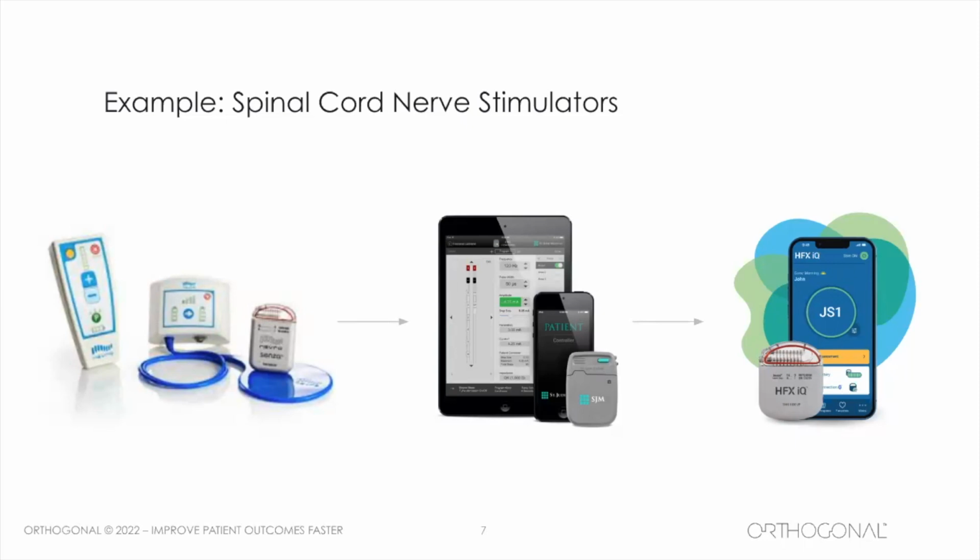At some point later on, St. Jude Medical decided to add Bluetooth to their spinal cord nerve stimulators and provide an iPod Touch with the nerve stimulator, and it was a much better and richer interface that they could provide with that.